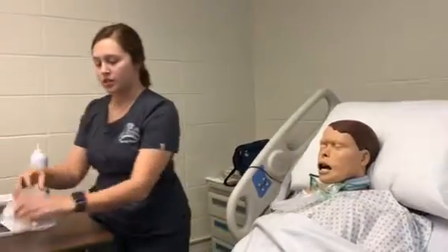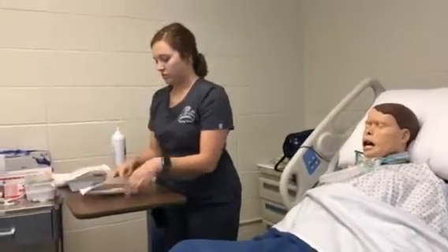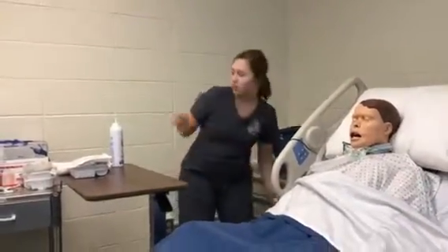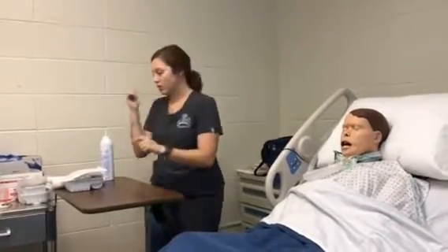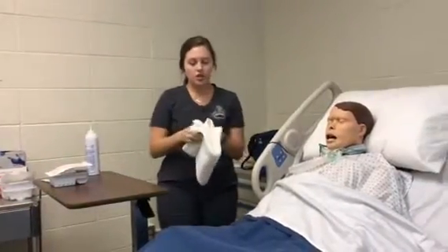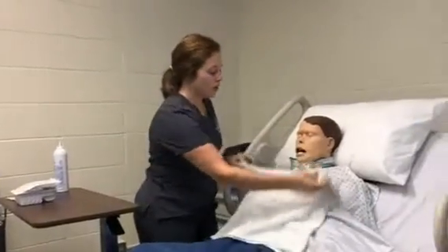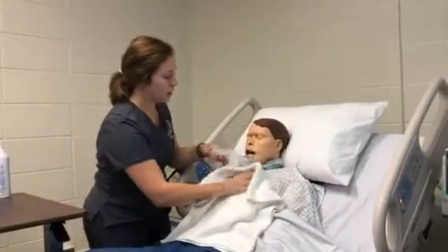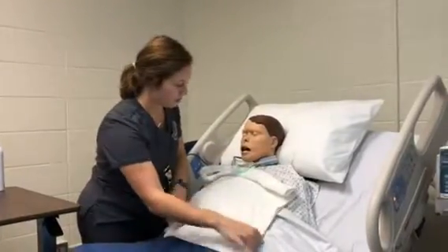Okay, and then we can dispose of all of this as well. I'm going to wash my hands. And we have this towel here. I'm just going to put it across his chest. This is just used to make sure that we don't soil our patient while we are cleaning the inner cannula of his trach.